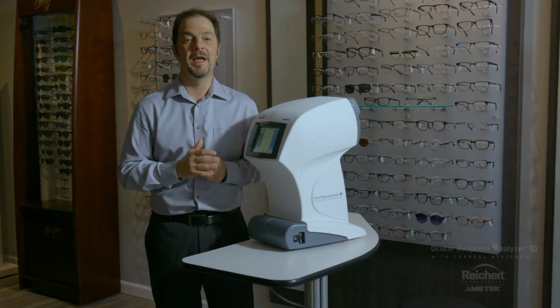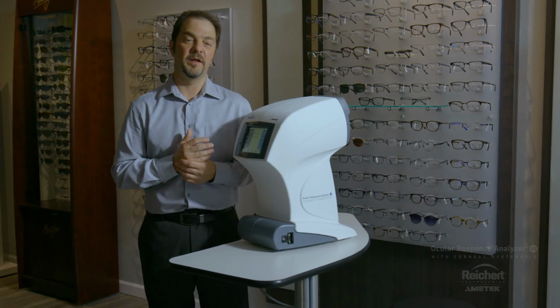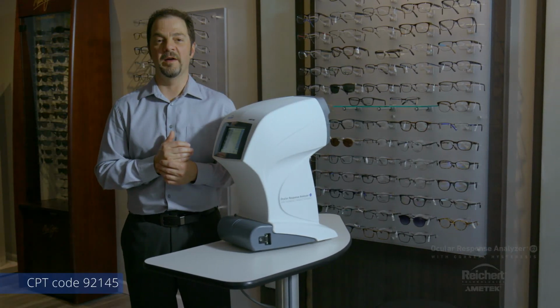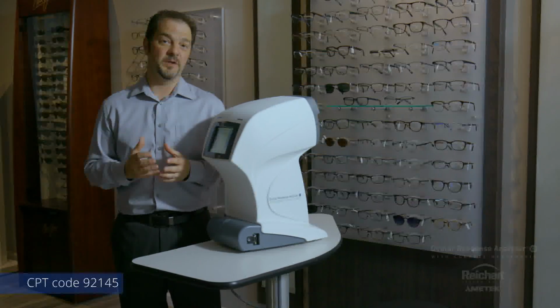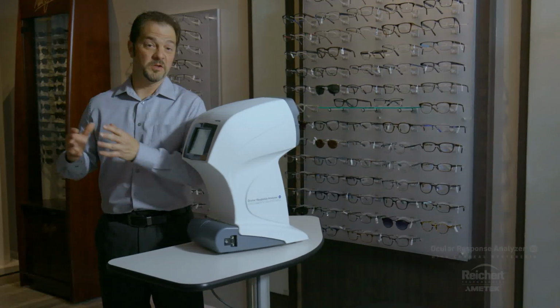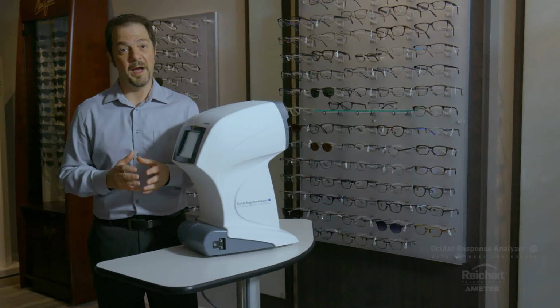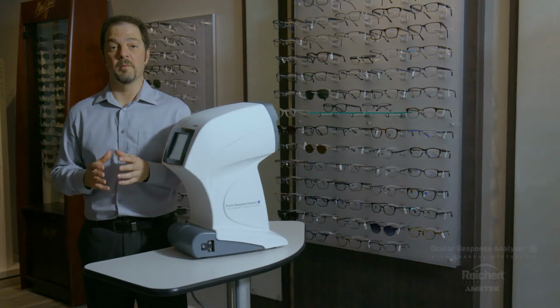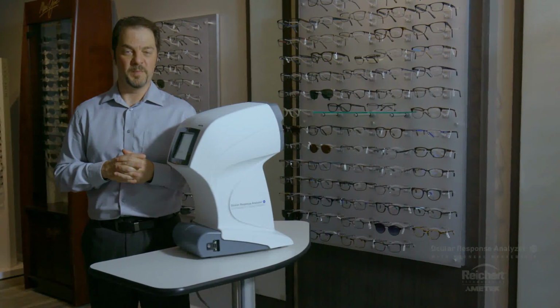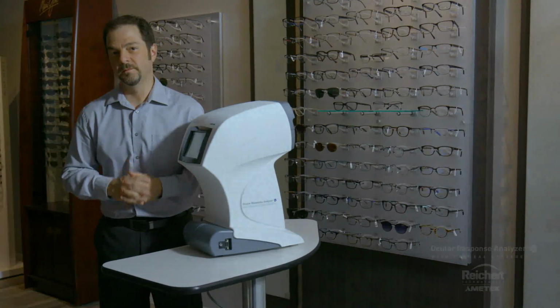Now, corneal hysteresis, because it provides such powerful information and because there's so much evidence in the literature of its clinical utility, now has its own Medicare reimbursement code, and that's CPT code 92145. Now, there's different Medicare jurisdictions in the United States, and of course there's lots of different private payers. Some payers will pay, some payers will not, and some payers will pay different amounts. So to fully understand billing for corneal hysteresis, it's best to consult your billing expert.